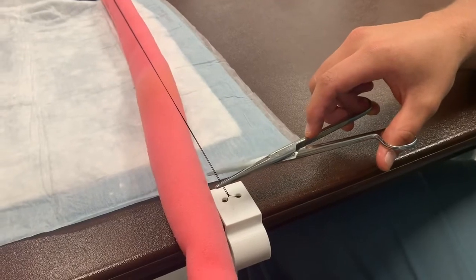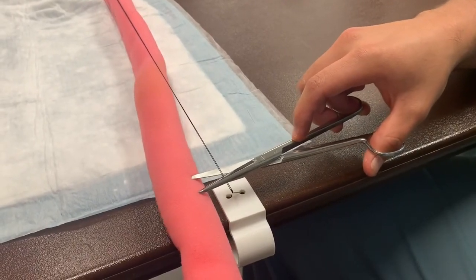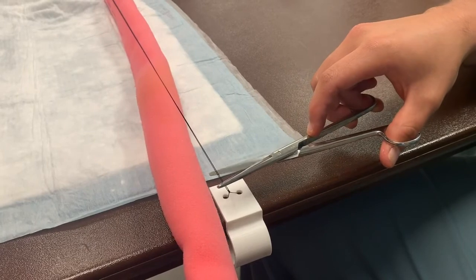While cutting sutures, you want to not go too far back in the scissors, as that can put unwanted structures in the radius of cutting.